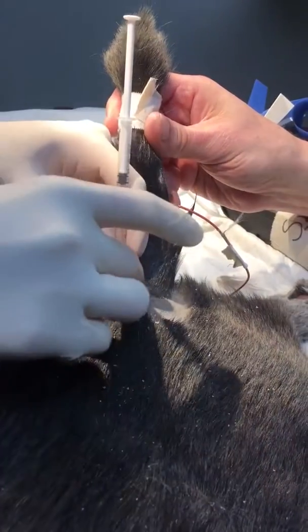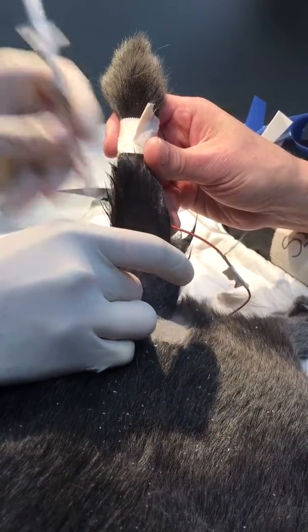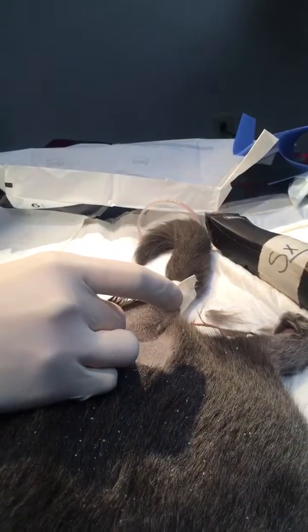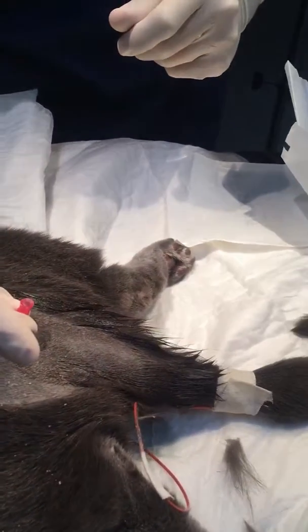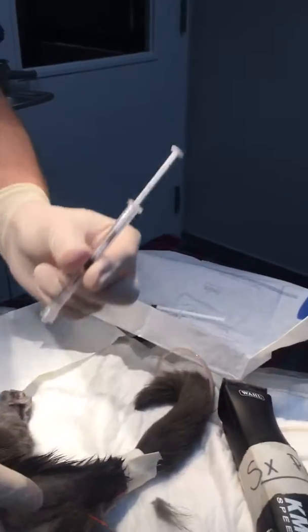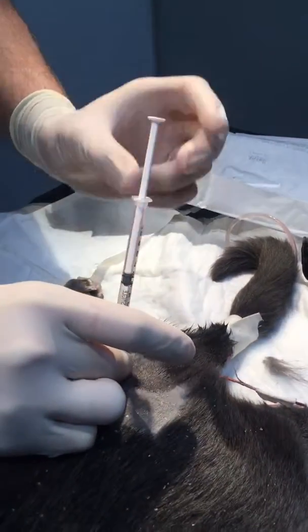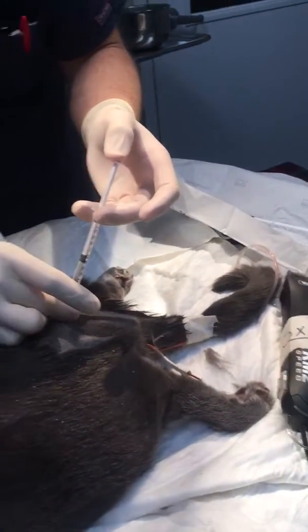So you want to leave the needle there and just take your syringe off. Do not take the needle out at all. When you give this, you should feel no pressure at all — it should go in like zero resistance. In fact, it should go in on its own a little bit as you go. It should follow through.